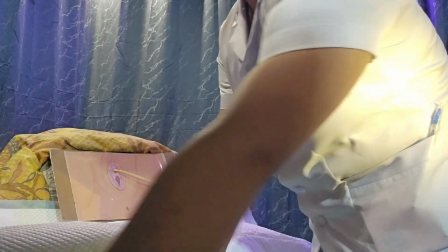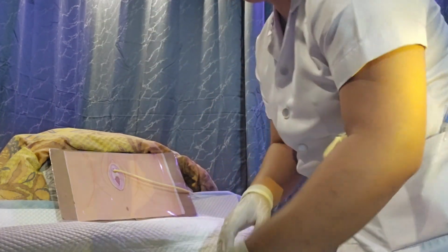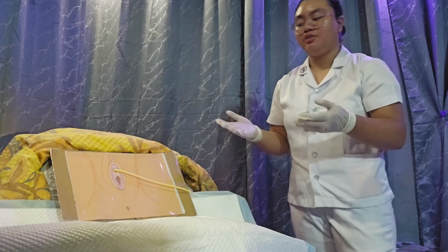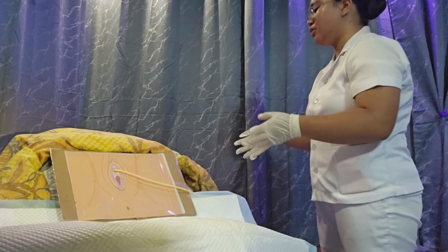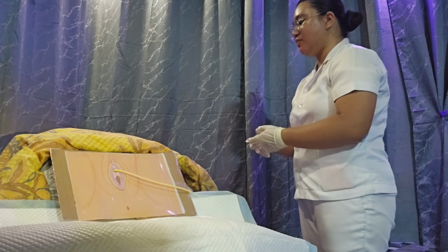And then after ensuring that we discard all the materials properly, we are now also going to ask the patient how they feel after the insertion of the catheter. So ma'am, what do you feel po? And do you still feel pain po ba?